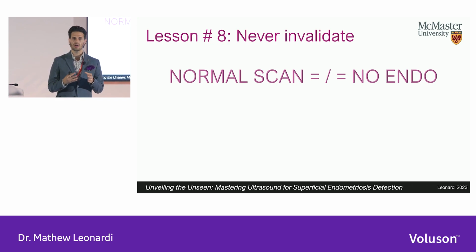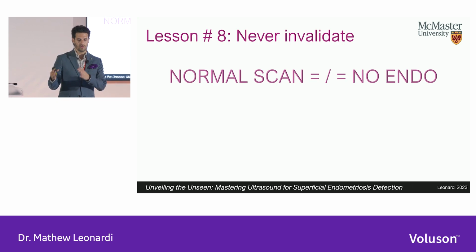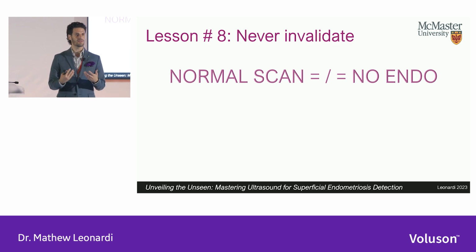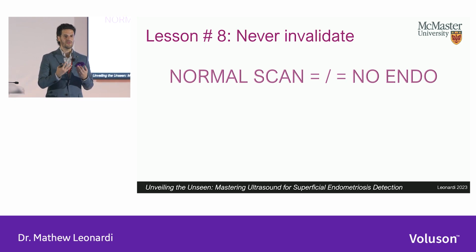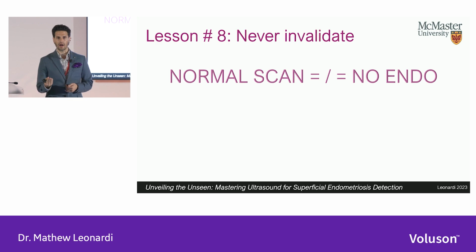I know that many of us are in the imaging sphere. We may not be managing the patients ourselves, but in my ultrasound world, where I'm not managing them, but I'm scanning them, I always tell them, I believe you. Your pain is real, even if the scan is normal. It still feels invalidating for them when that scan is normal because it's discrepant to what their experience is. But we have to go over and above to validate them, to make sure that they know we believe them, and that the diagnostic process may not stop with that particular scan, may require further laparoscopy for diagnosis and or therapy.